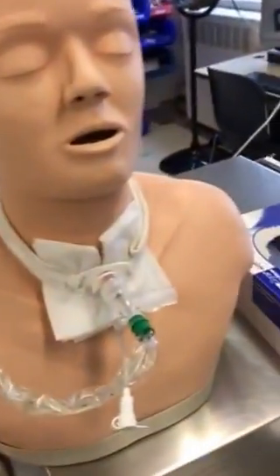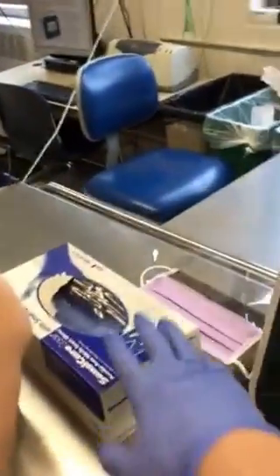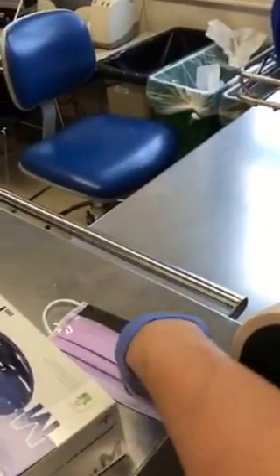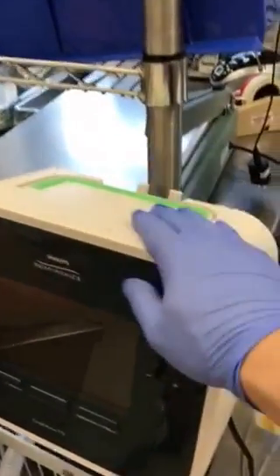First things first, you want to make sure you have protective gear for our patient. Since it's going to get pretty down and dirty, you want to make sure you have your gloves on. You want to have your face shield because there's going to be a lot of secretions coming up. Since he's a C2 fracture, ASIA A, make sure you have your O2 power source plugged in.